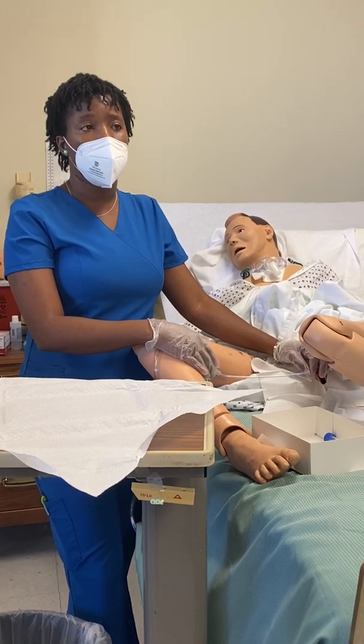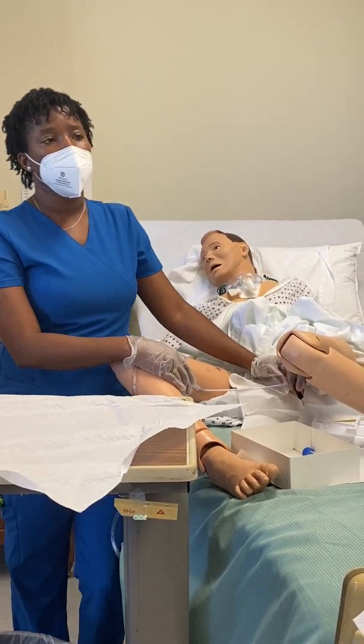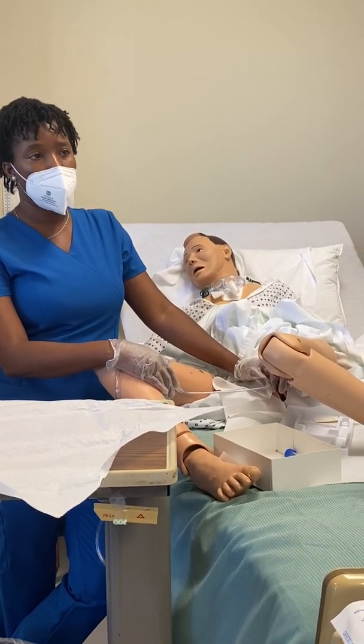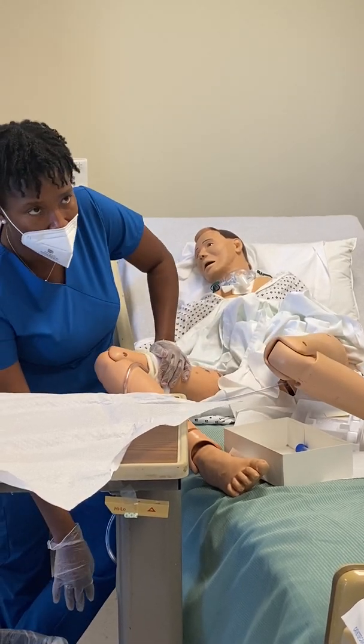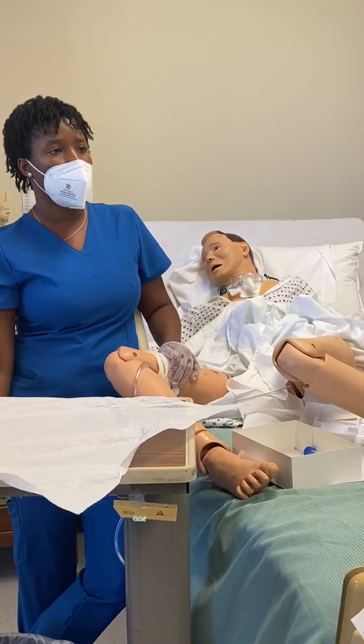So in that situation, after the catheter is in, before you put the thing on the leg, you don't put the thing on the leg. That's confusing you guys. Just say I'm gonna tape it here to the leg. You just hold it with your hands and put the bag on the bed. Don't get focused on that part of it. That's not a part of the procedure.